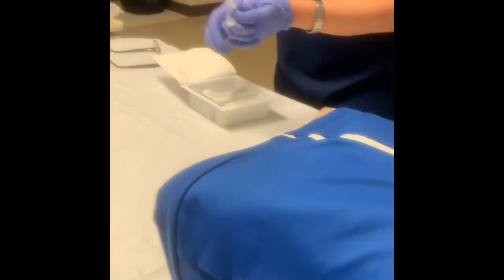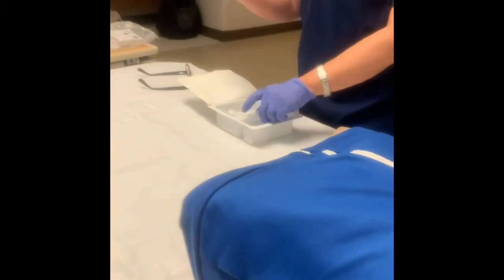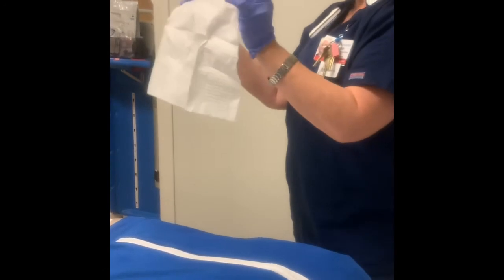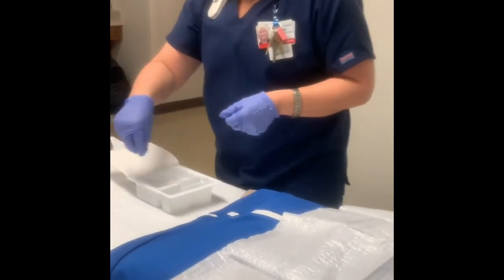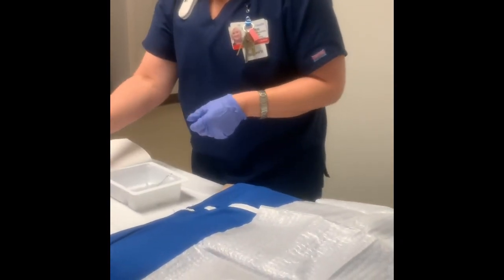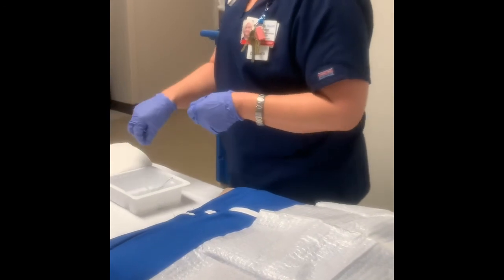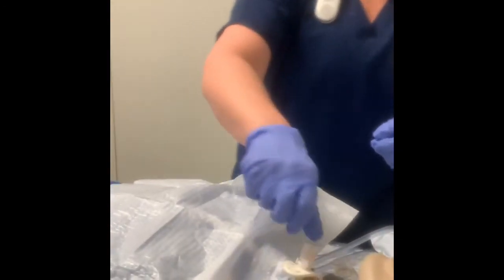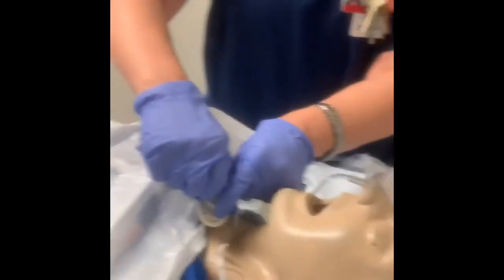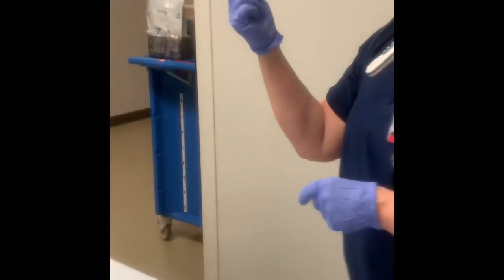So you have a bunch of 4x4s, you have your pipe cleaners, etc. And I usually like to put this on here. Banner doesn't really speak to it. I like to put it here, only because I can put my discards right here. Then you have a tray that you have your 4x4s here. You want to put your normal saline in here, okay? Then I want to go take out my inner cannula right here.